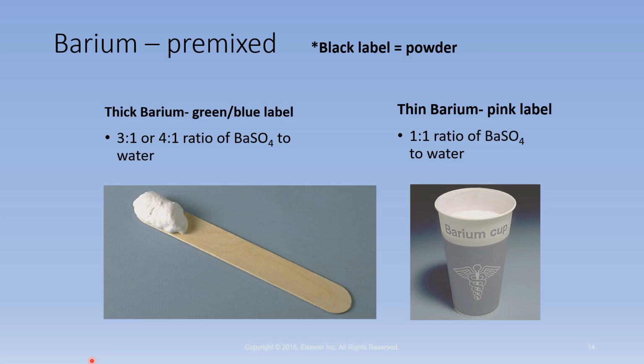And what they're trying to figure out is what the patient can and cannot tolerate as far as when they eat, what causes them to start to choke or not be able to continue eating. Usually it's a stroke patient, and it's performed by a speech therapist, and then we are also in the room. Typically us, a speech therapist, and the patient are the only ones in the room.